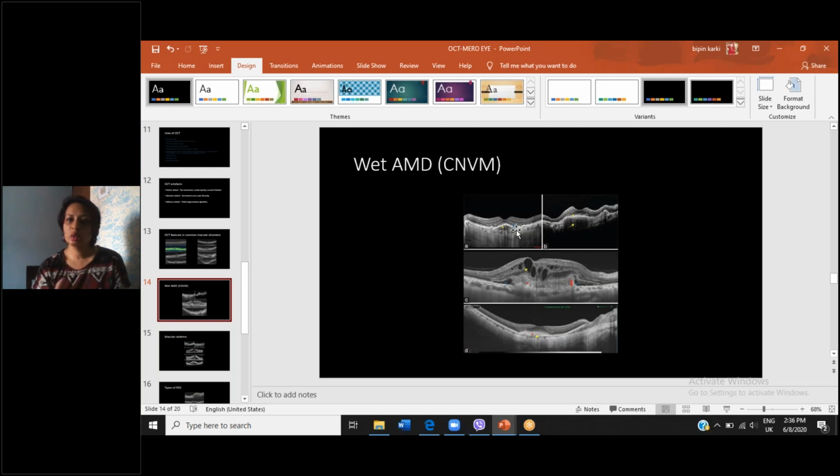This is dry macular degeneration going into wet, where there is subretinal deposits, subretinal collection of fluid happening there. So different stages of macular degeneration. As you can see on this one, this is a progressed macular degeneration where there's intraretinal cyst, the macular foveal contour is all distorted. You can't really see the nice pitted foveal pit there.